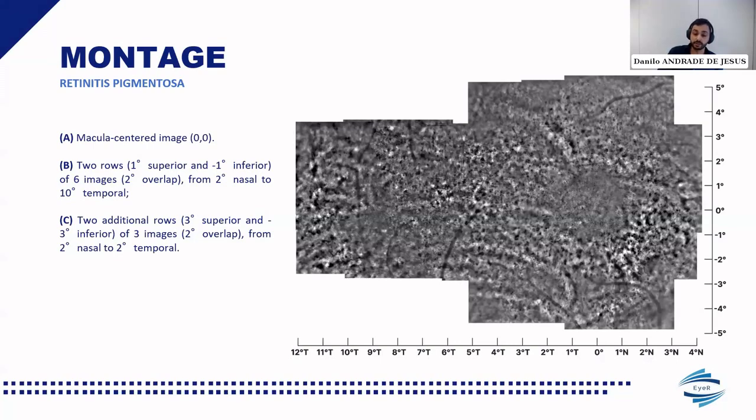region. So this is very important in advanced stages in order to see the atrophic ring, as you can see here in this image. And then we can also do the follow-up of this atrophic ring. So this pretty much in a nutshell summarizes what we did in terms of standardization of the image acquisition.